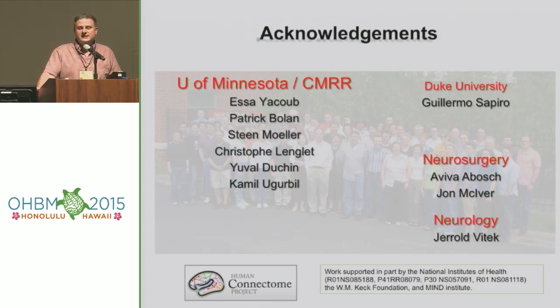We had a study in which we took 12 patients that were scanned on a 1.5 and went through the entire process of DBS as we do it today. These patients were scanned on a 7 Tesla as well, and then we looked at the registration between the 1.5 and the 7 Tesla. The whole idea was to figure out if we can use the 1.5 as the gold standard, because it's being used today. We have to see how much distortion we get between the 1.5 and 7, and if we are okay with that, then we are safe.